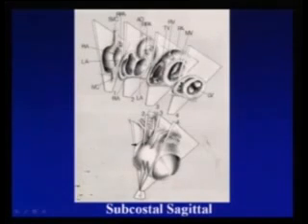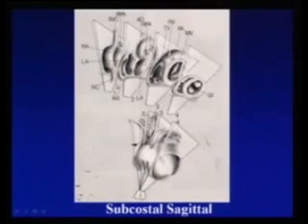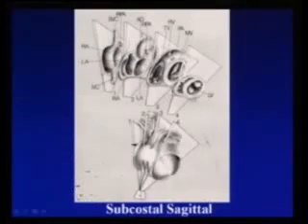Most right will be the atria, the interatrial septum. In the sagittal plane you get the SVC connecting to the right atria, and the IVC connecting to the atria: the bicaval view. This IVC connection to the atria is very important because the suprahepatic portion of the IVC defines the morphological right atria, not the right sided atria, the morphological right atria. If it joins the left atria, it will be a morphological right atria on the left side. So you have to define where the IVC is going, to the left sided atria, to the right sided atria, to the floor of the atria. So this suprahepatic portion is very important.